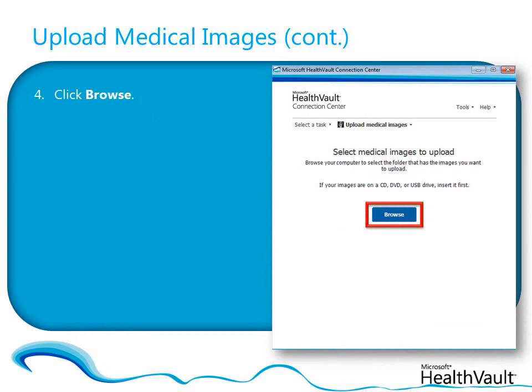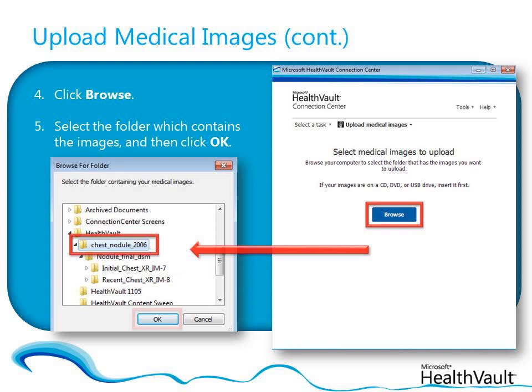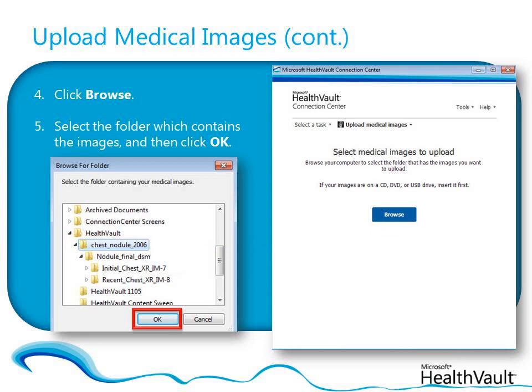If the images that you want to upload are stored on a CD or DVD, make sure that you insert the disk first. Click Browse, find and select the folder which contains the medical images, and then click OK. Connection Center will upload all of the images in the folder that you select, so make sure that you move any images that you don't want to upload into another folder first.